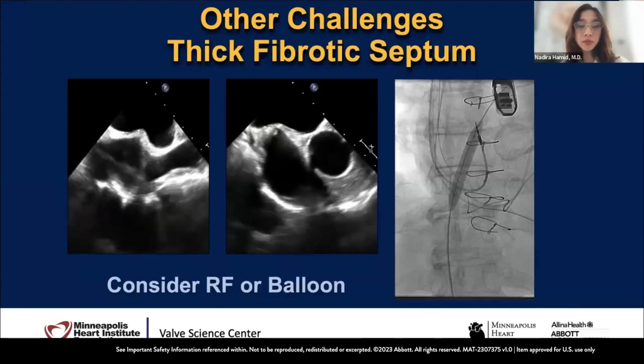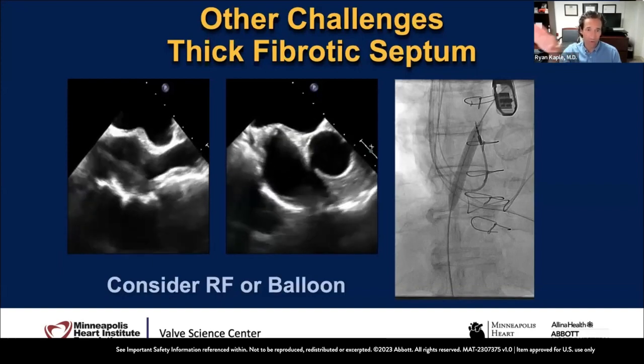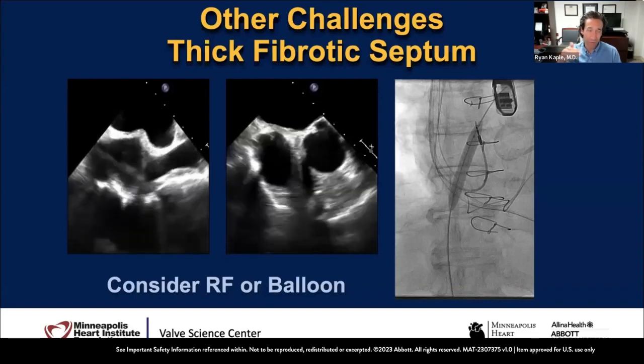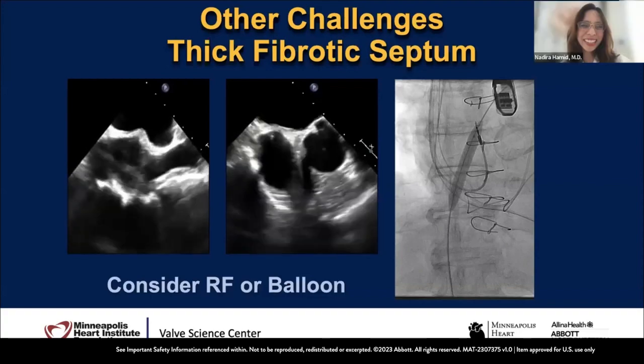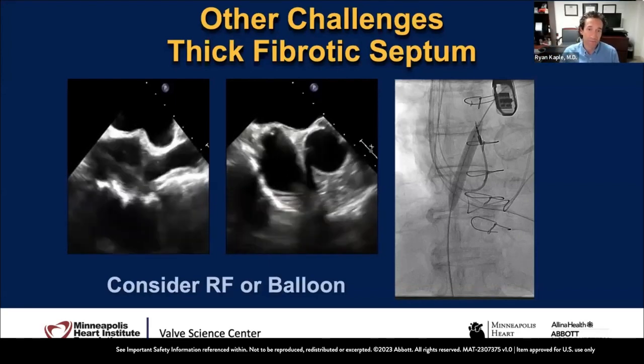I like to do a quick cine burst right before I go across, so that I know where the septum is on fluoro. We also use echo fusion and CT fusion as a way to plan the transeptal, which feels like cheating sometimes because it is such a help. But when you have to balloon, you know where you made the transeptal, so it does help.